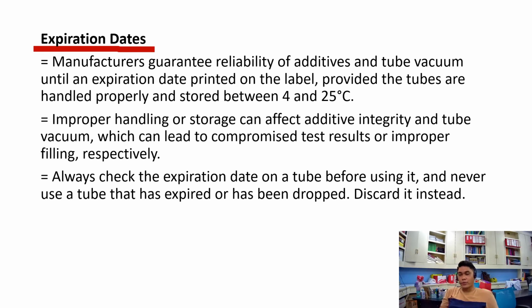For example, if the tubes were exposed to high temperature, it can cause deformity to the tubes, and can also cause a problem with the vacuum and the potency of the additive in the evacuated tube, which can lead to compromised test results or improper filling.